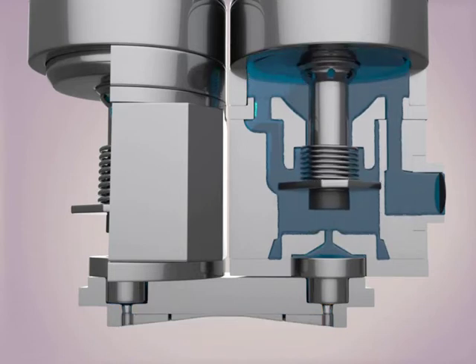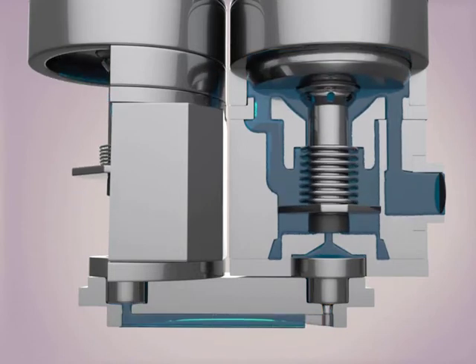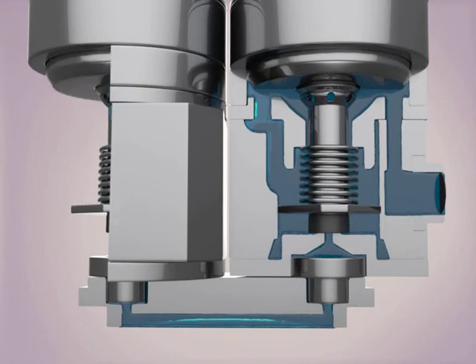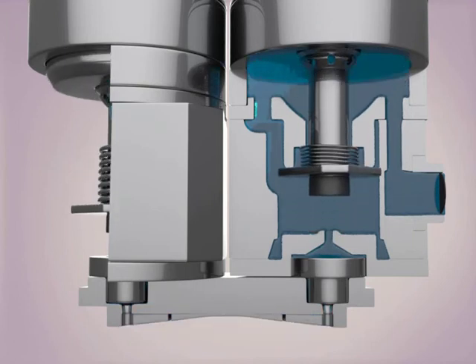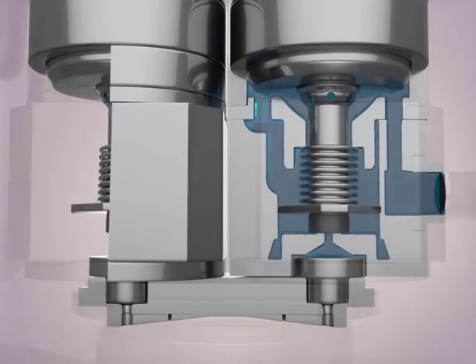These valves function without the need of a motor, reducing the number of moving parts inside of the Prometria-2. Having less moving parts leads to a long battery life of 10 plus years.